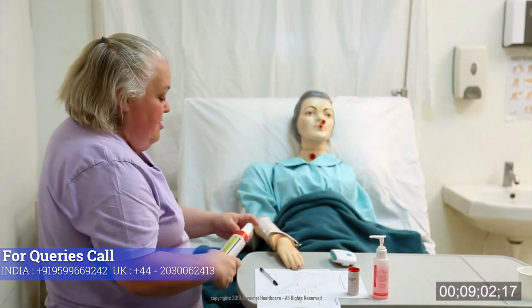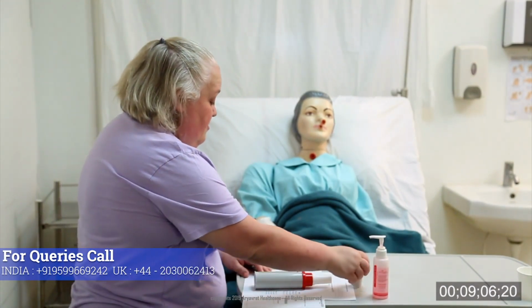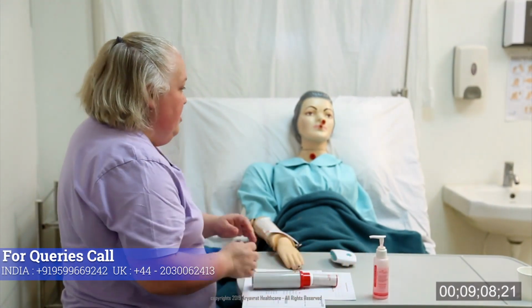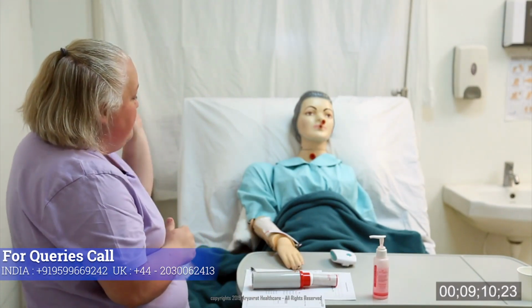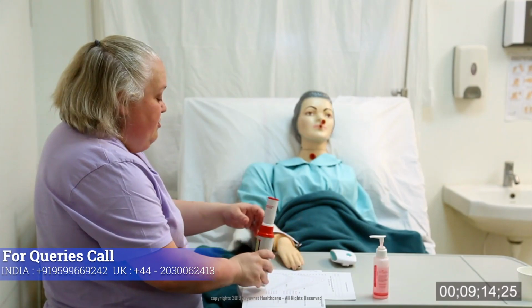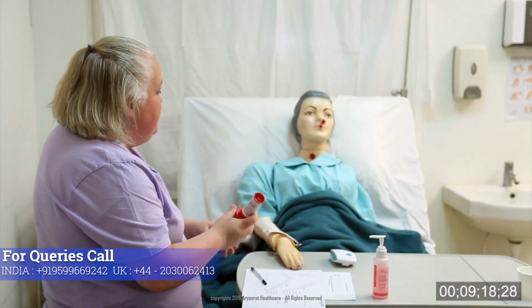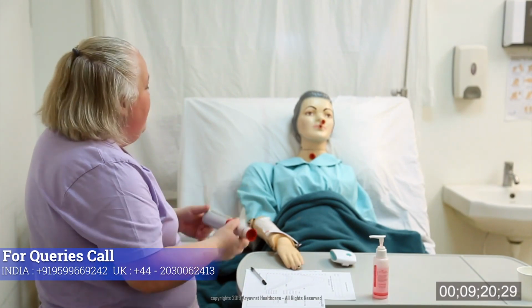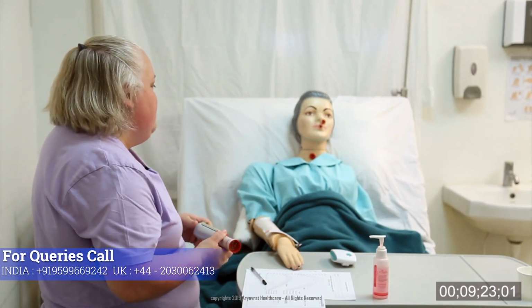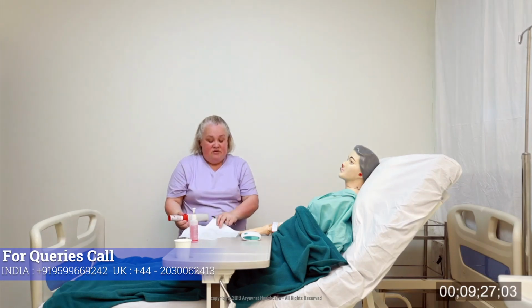Okay? Are you happy with what we've gone through there? Yes, that is quite a bit of information, but yeah, I think I've got it. Okay, so whilst you remain on the ward as an inpatient, we will be helping you to do this before and after your medication, so that by the time you go home, you're fully au fait with it and it's all up and running. Is that okay? Okay. Okay, I'm going to take this away now.